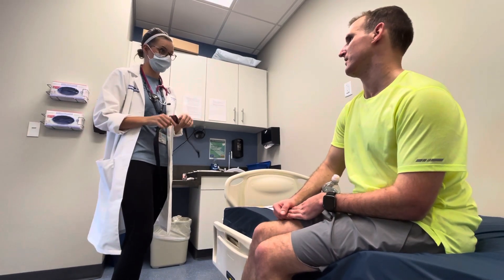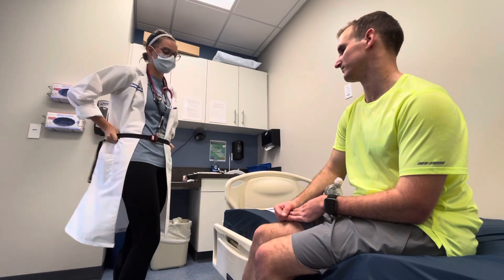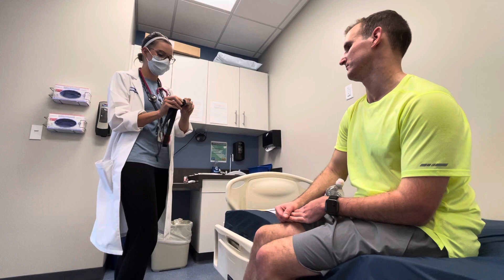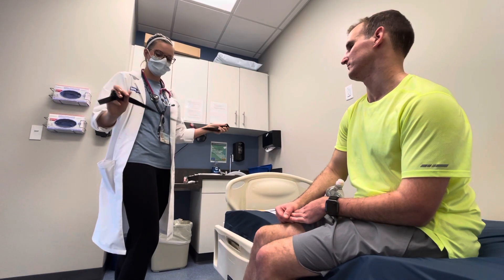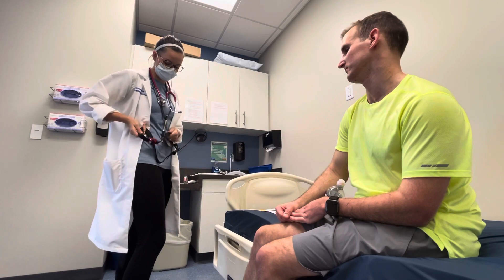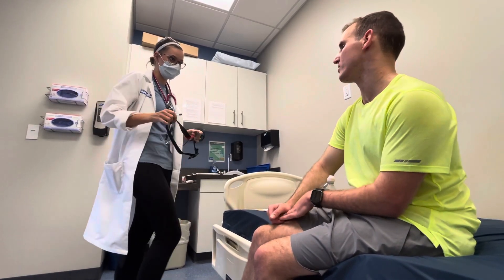You're going to wear it every day. See how it's on an elastic strap — make sure it's nice and snug across your waist. You can adjust it to make it tighter, and then you want to clip it. It shouldn't flop around at all when you have it on. It should be nice and snug.